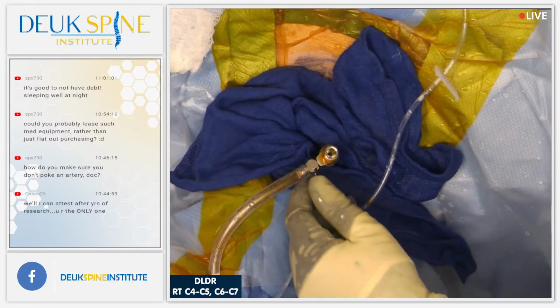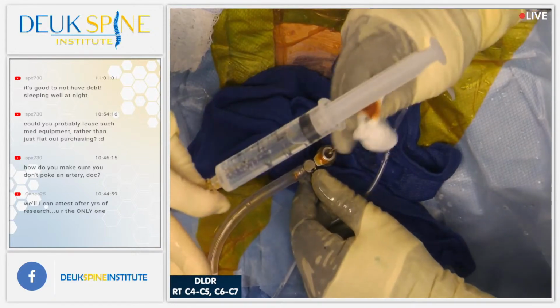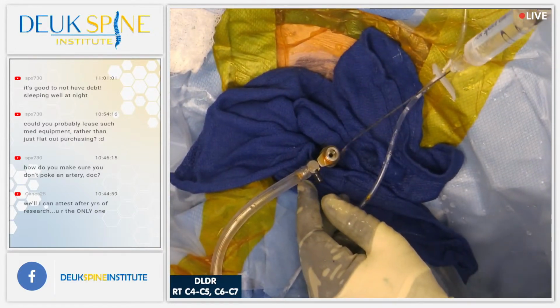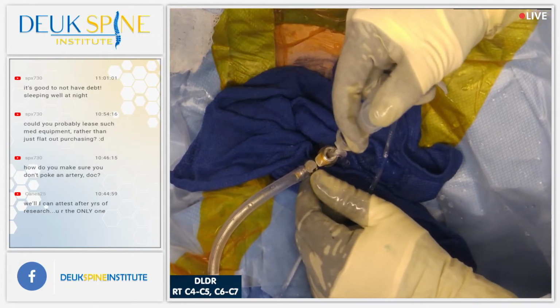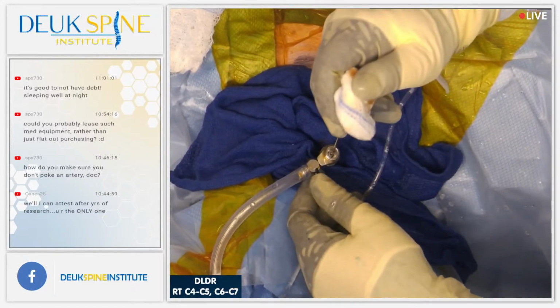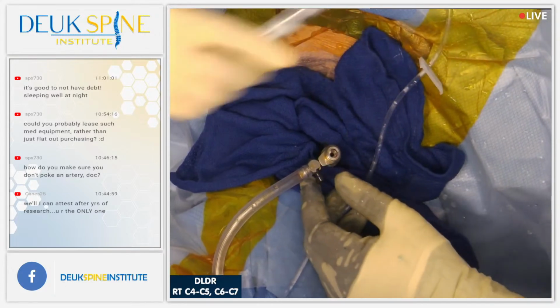The bottom disc was also degenerated, but not as bad as the C4-C5. So we fixed the degenerated and herniated discs. The bottom one was a lot more exciting, great anatomy, great lessons to see: the nerve root, the spinal cord, the herniation sitting on top of the spinal cord. That was kind of fun.